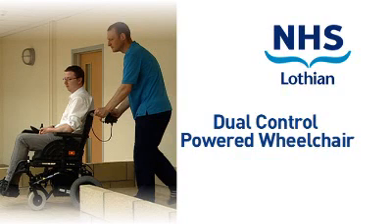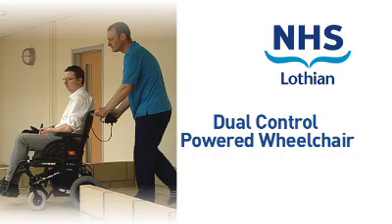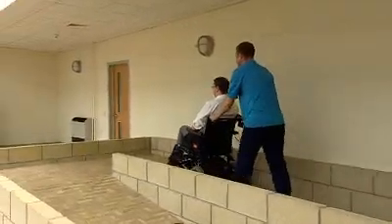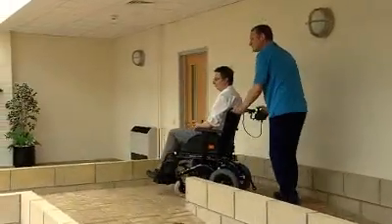Welcome to the Smart Centre demonstration on the use of a dual-control powered wheelchair. This video is relevant for both adult and children dual-control powered wheelchairs. If you wear glasses, these should be worn at all times when using a powered wheelchair.